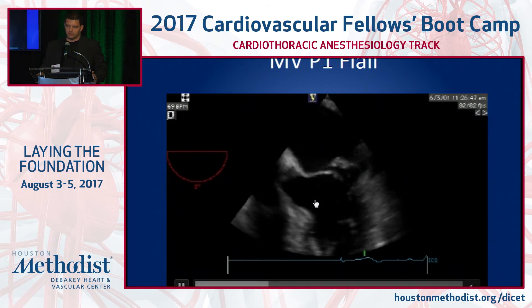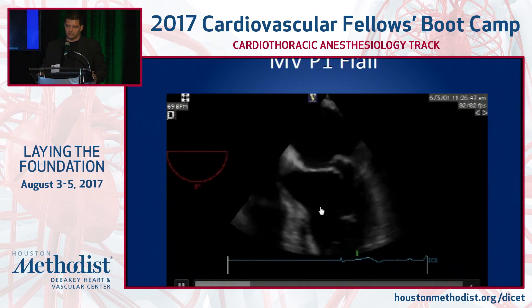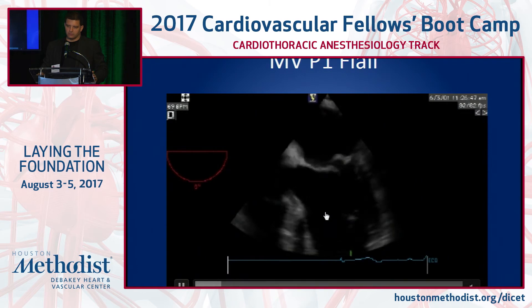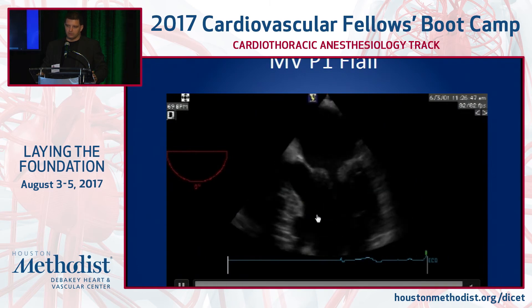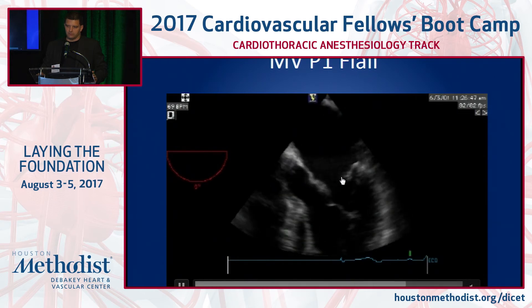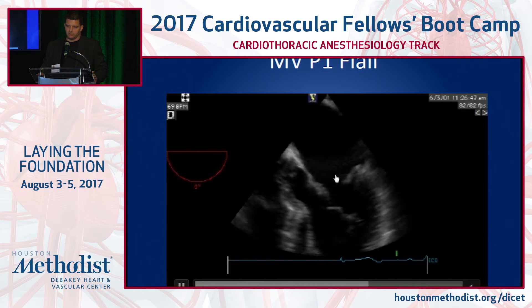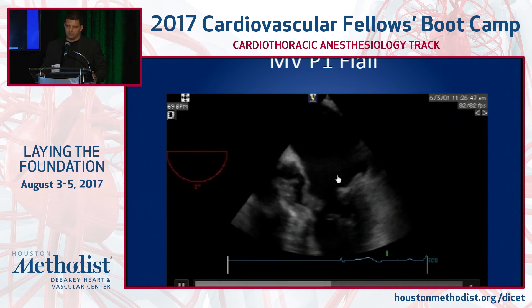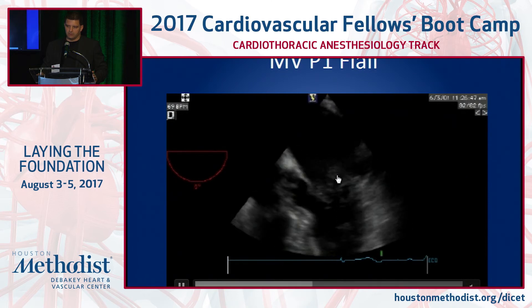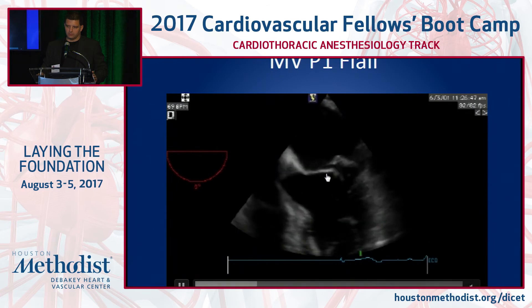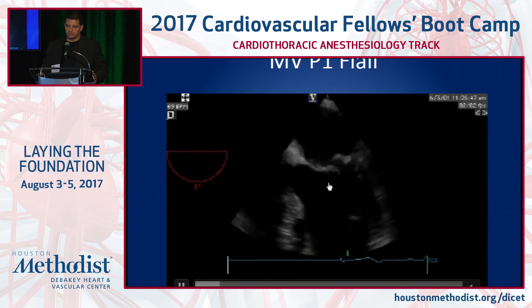The P1 flail — basically the same image, a different patient. You're looking at a four-chamber view. You can see the anterior mitral leaflet on this side, the posterior mitral leaflet on that side. You see the piece of the posterior leaflet flailing into the left atrium, with the little broken chorda tendinea right there.